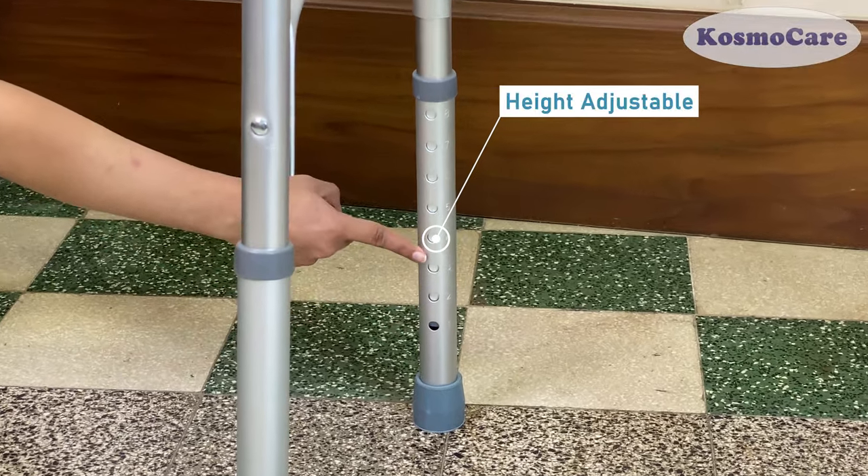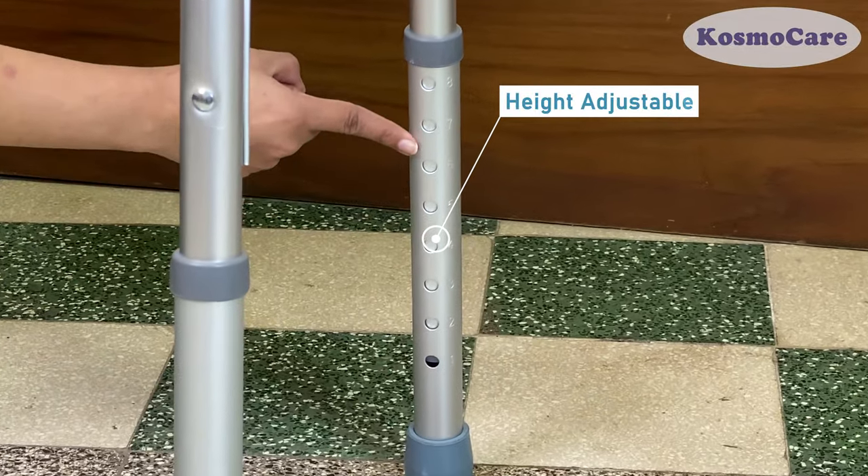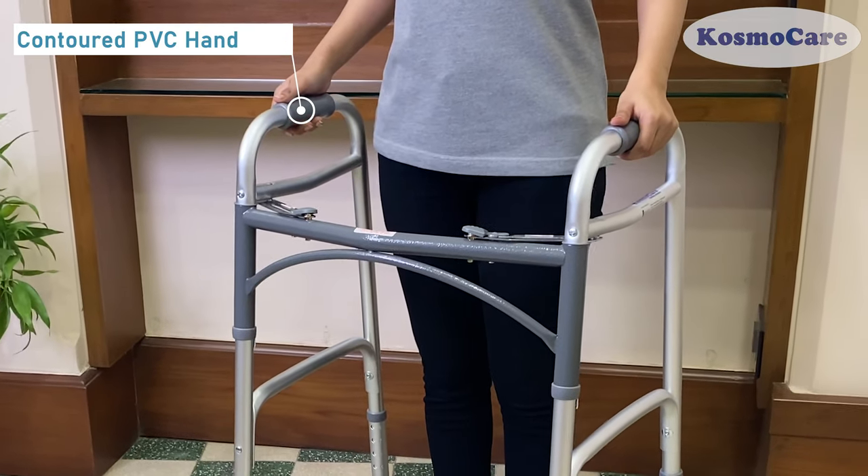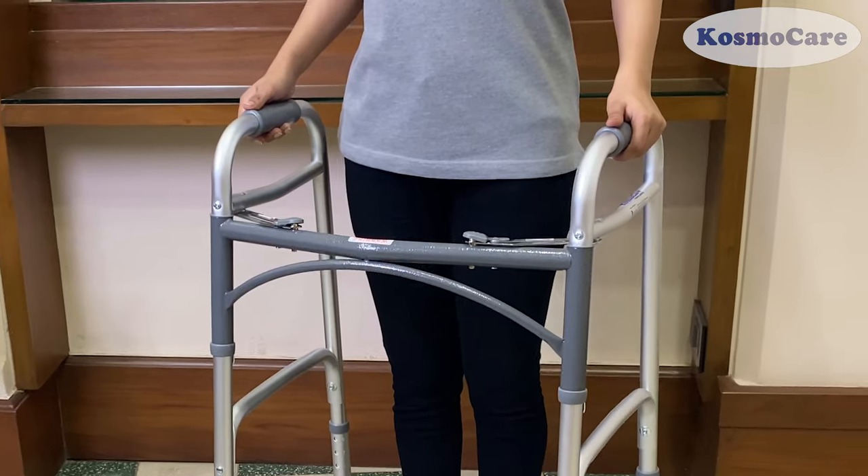Adjust the walker height to provide the perfect customized fit. Textured, contoured PVC handles offer extra comfort and stability.